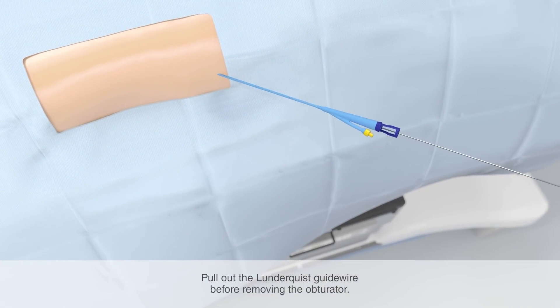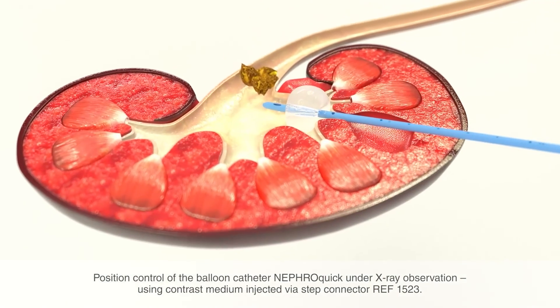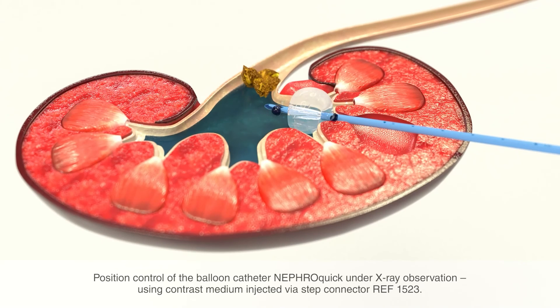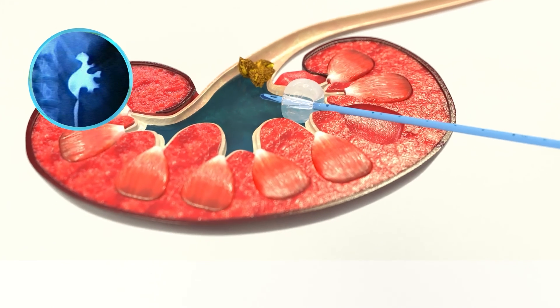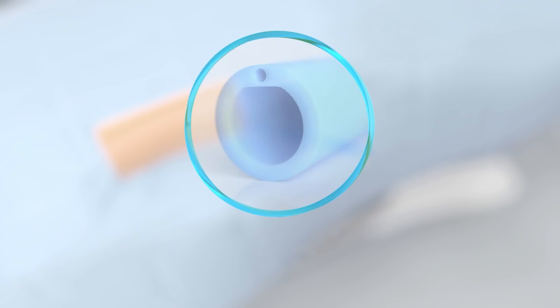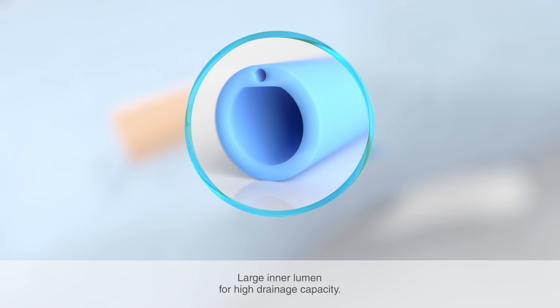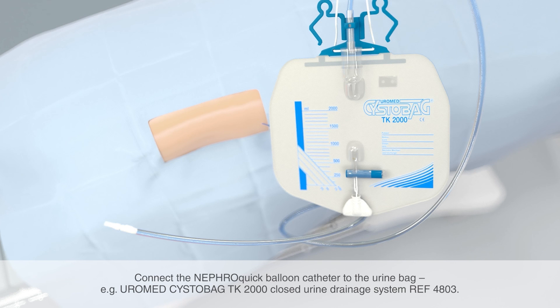First, remove the Lundqvist guide wire before pulling the obturator out of the balloon catheter. Then pull out the obturator completely from the balloon catheter. To control the position of the balloon catheter, a contrast medium is first injected via the catheter via a step connector, for example reference number 1523. This way, the kidney region can be depicted by x-ray and the correct positioning of the balloon in the renal pelvis can be confirmed. Thanks to its large inner lumen, the balloon catheter ensures a high drainage capacity. To collect the urine, the NephroQuick balloon catheter is connected to a suitable urine bag, for instance the Uromed CystoBag TK2000 closed urine drainage system.